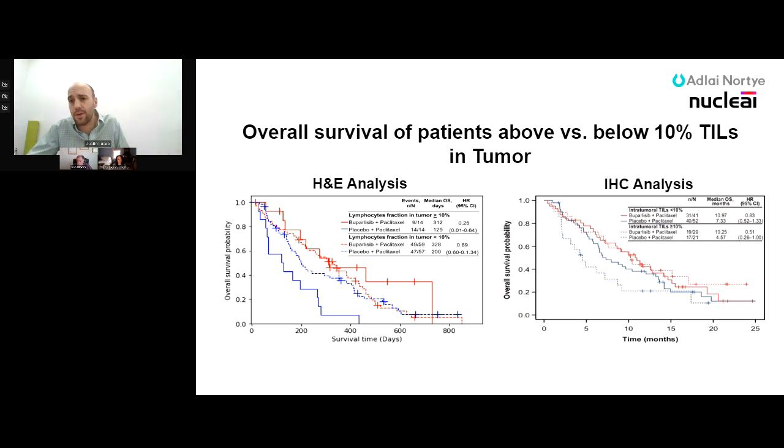This is a very common biomarker, especially used in immuno-oncology. And the 10% cutoff is a pretty standard cutoff. If you have more than 10% of your immune cells that are CD3 positive, you would be in one category. If you have less than 10% of your immune cells being CD3 positive, they would be in another category, right? And so that's how we always have to set in biomarkers some sort of median or divide between the two different categories that we're comparing with clinical outcome.